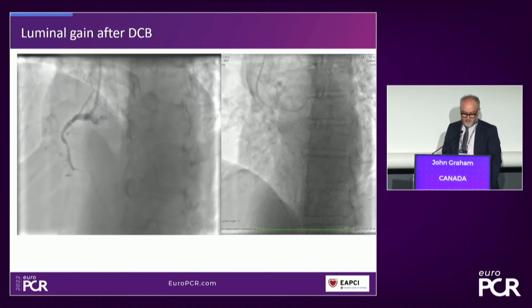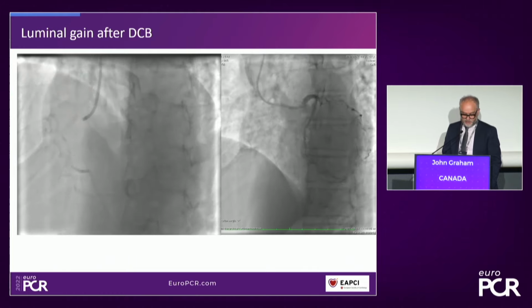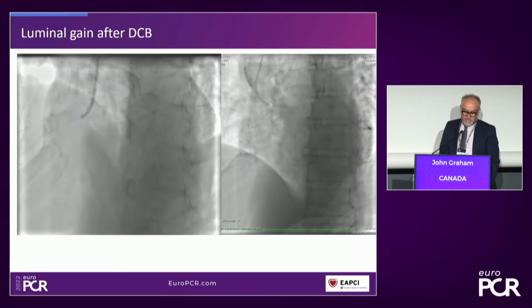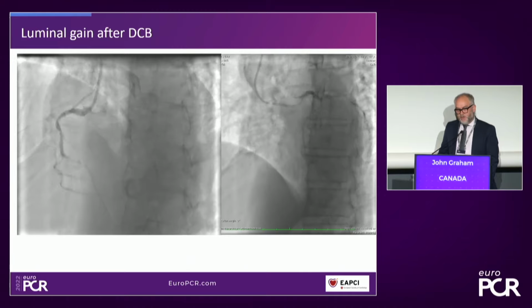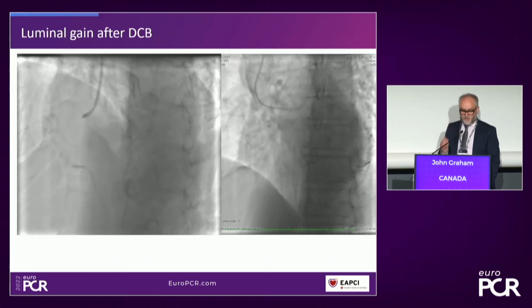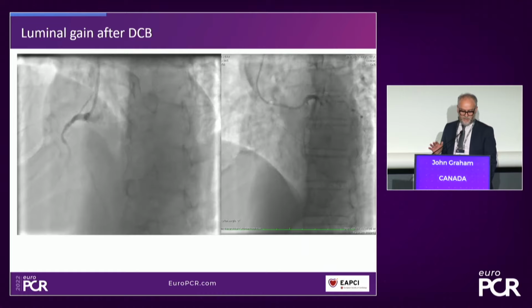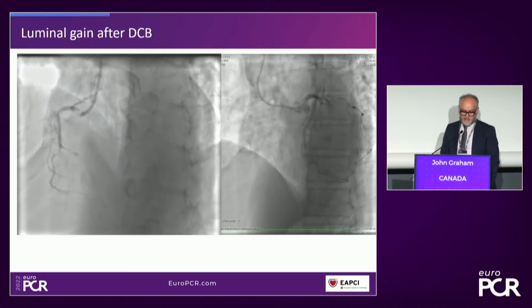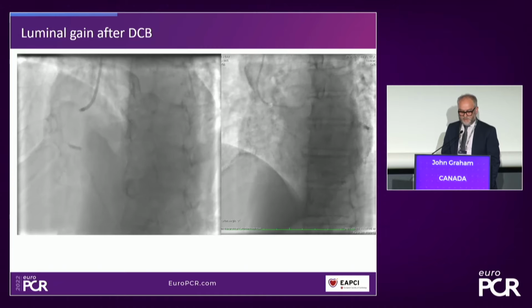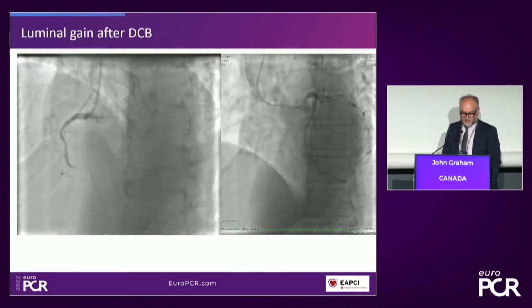And the angiogram has shown that he's got a chronic occlusion of his distal right coronary artery that was backfilling from the left system. And he was actually taken off the table. He was commenced on a beta blocker. His symptoms improved a little bit, but because they were going to be intubating both bronchi and with selective ventilation, there was a feeling that the hemodynamic upset may be pretty extensive, and there was reluctance to operate with this. And he was referred back for a consideration of angioplasty.